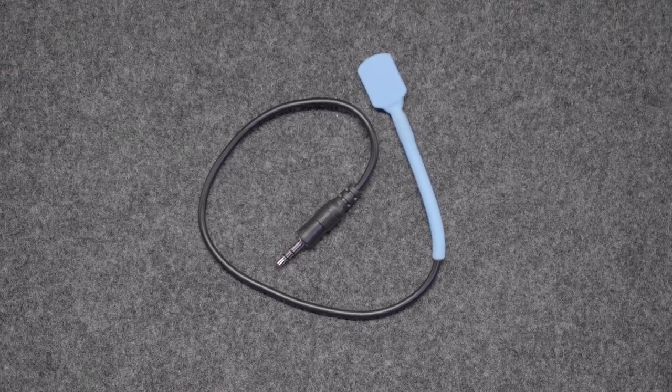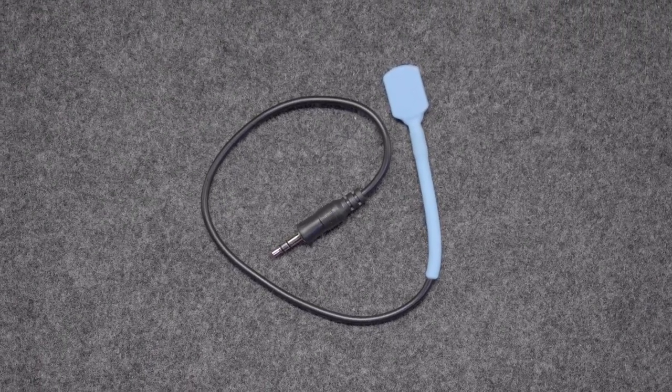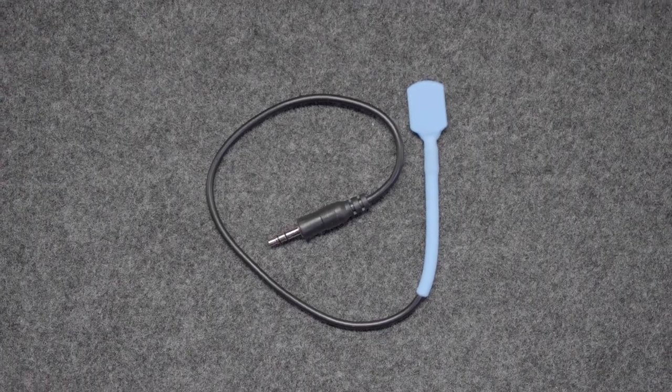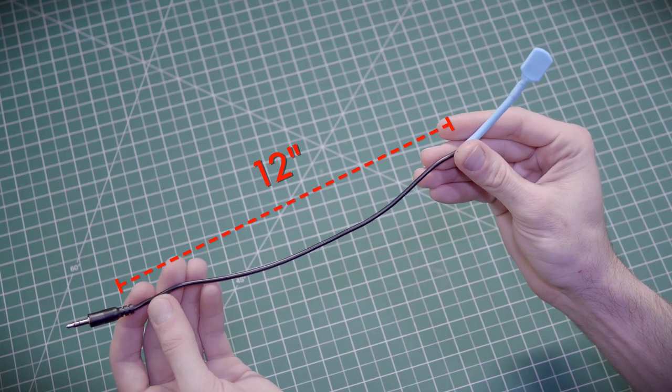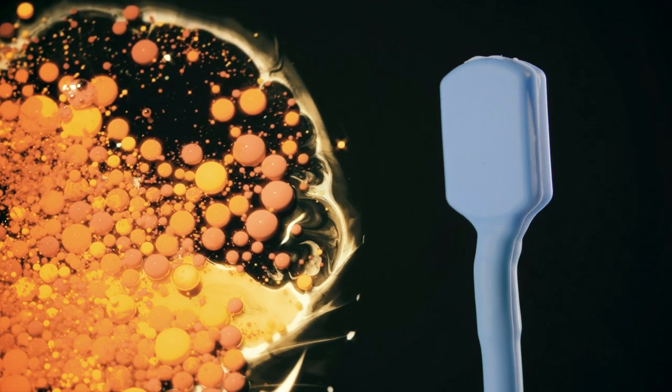The Airturn Byte Switch is a mouth-activated switch that controls games, music, cameras, pages, and more. The Byte Switch is attached to a 12-inch long malleable wire and covered with FDA-compliant food-grade silicone.